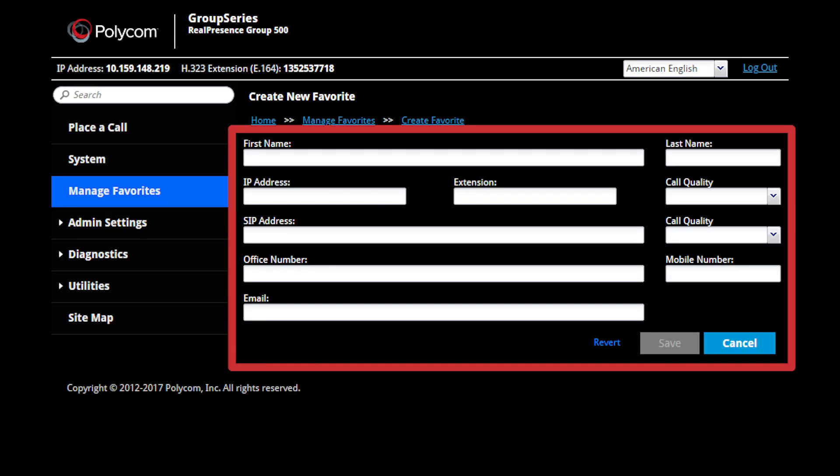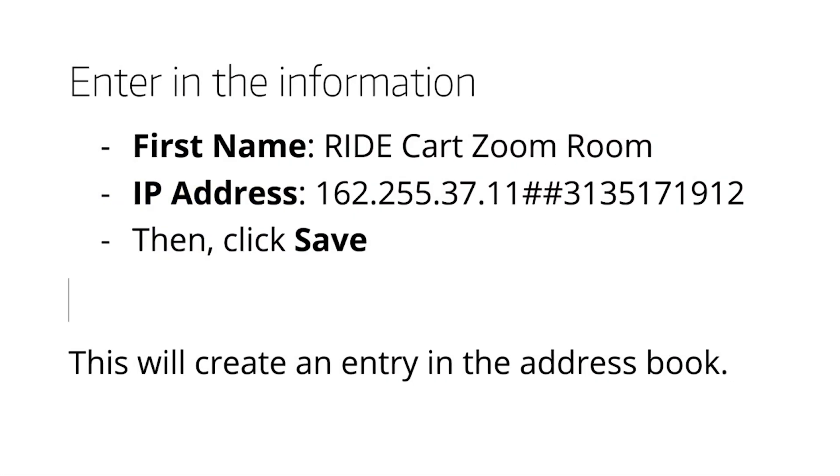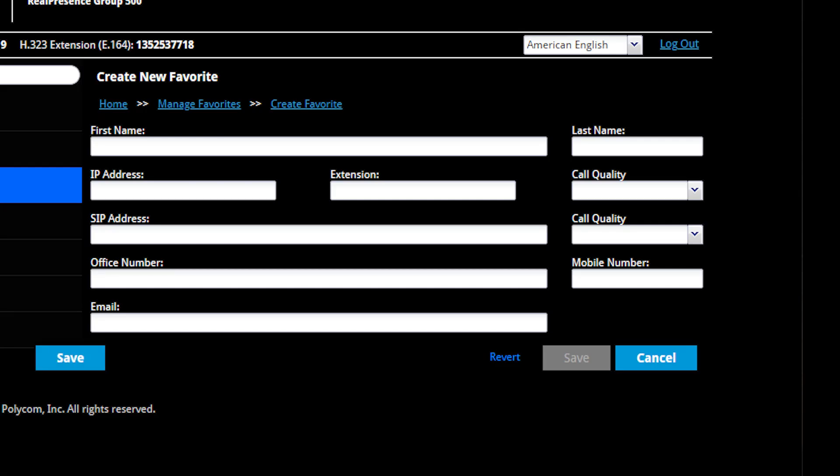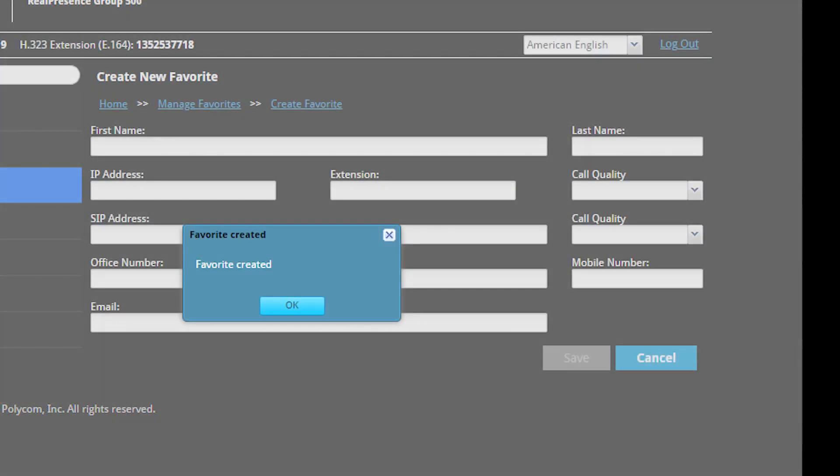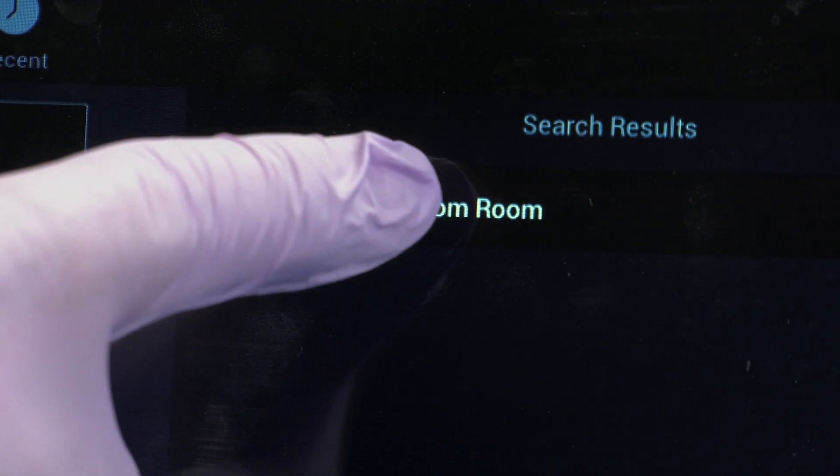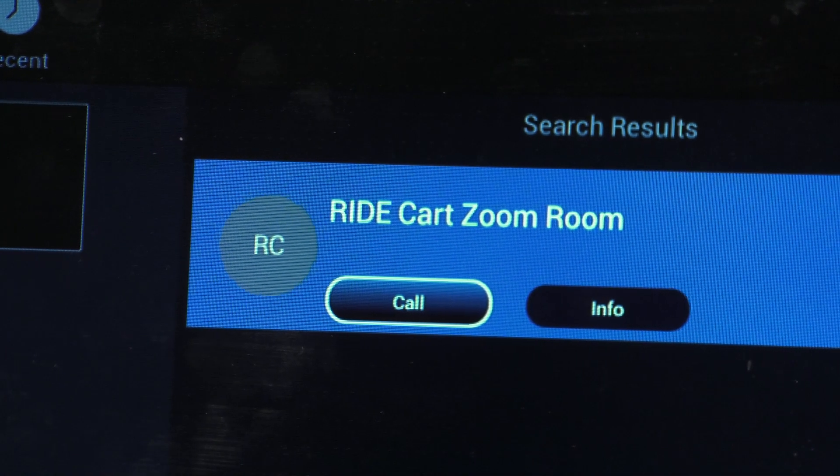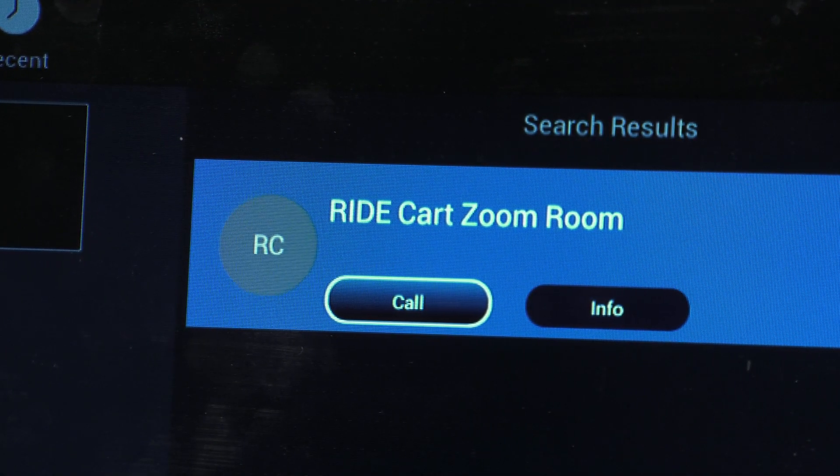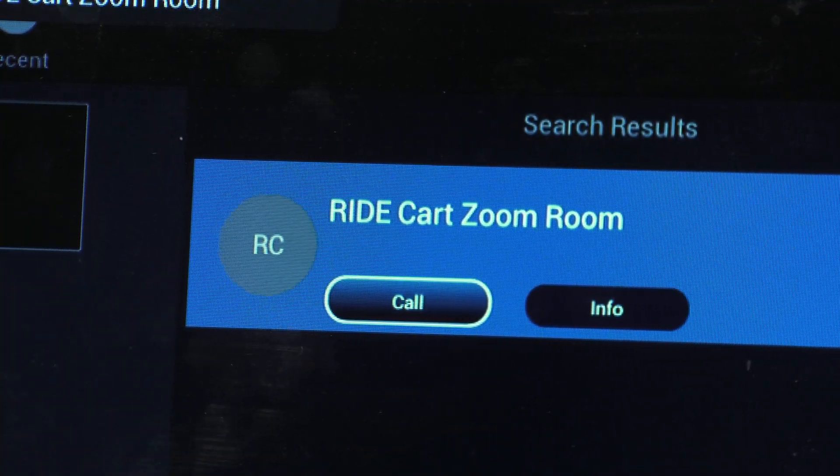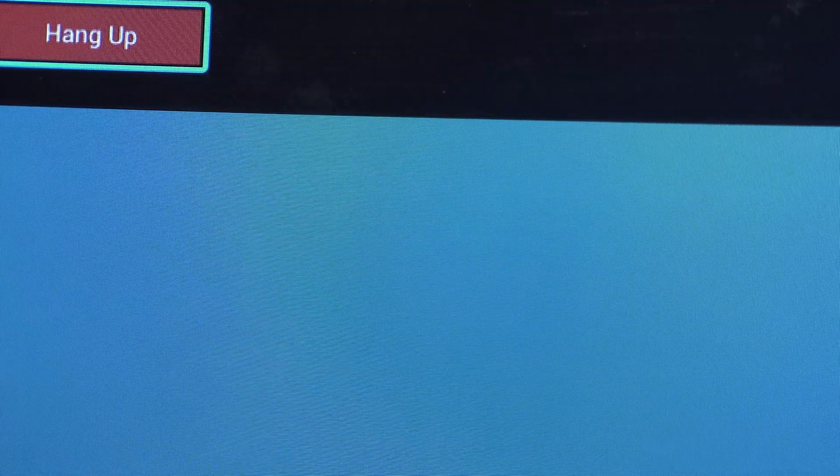This will open a new section to enter details. Enter the room and dial number in the first name and IP address boxes, respectively. Click Save to create the favorite. When complete, the Zoom room will appear in the contacts section of the Polycom's on-screen interface, which is located by tapping Place a Call, Contacts.